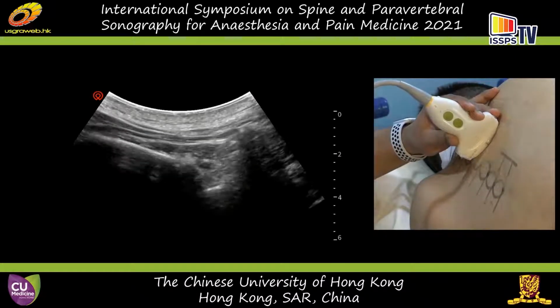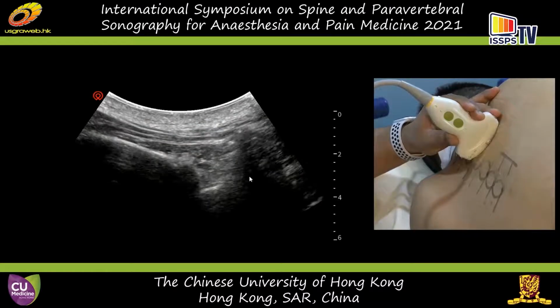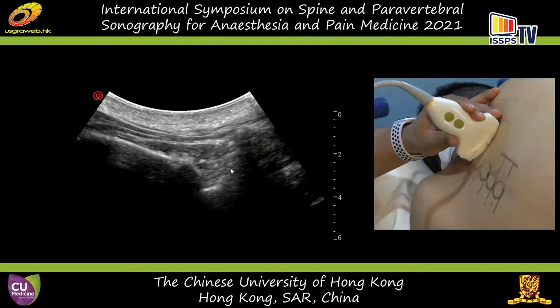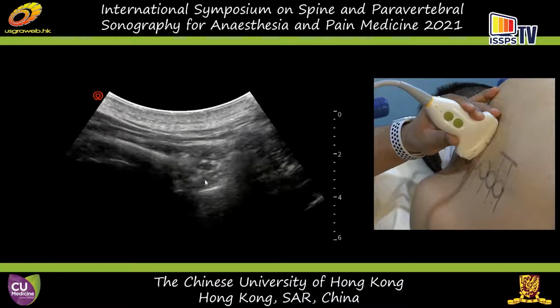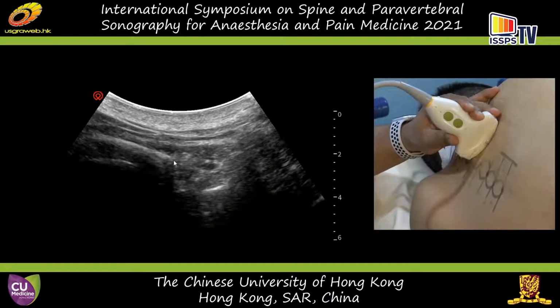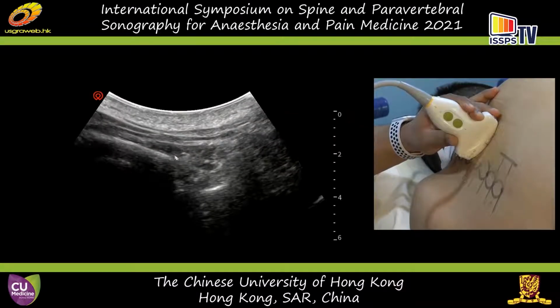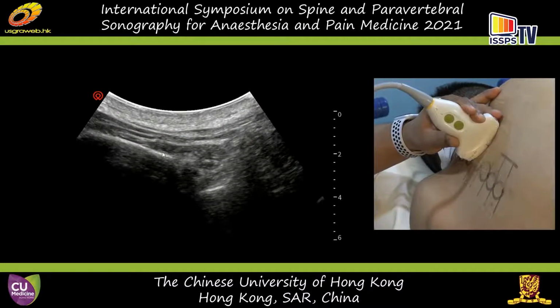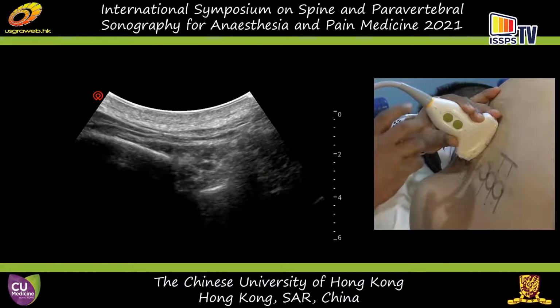So that's the spinous process you can see there. Okay, the lamina you can see down here, yes, and the posterior directed transverse process. The transverse process directed posteriorly, and then you have the costotransverse articulation. You can see that the ultrasound is producing some reverberation artifacts in that area, and then laterally you have the rib. So this is the first window that we want to acquire.